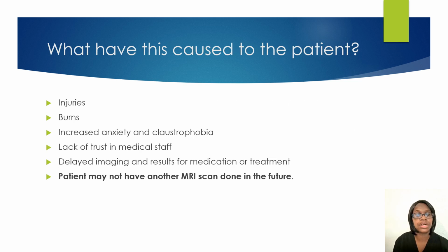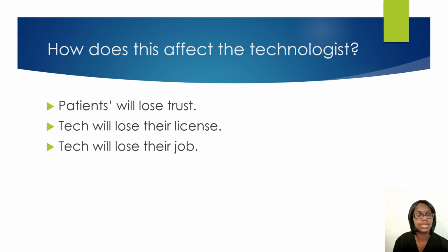Whenever things like this occur to the patient, it can cause injuries, it can cause burns, it will increase anxiety and claustrophobia fears, it will cause lack of trust in the medical staff, delay imaging and results for medication or treatment, and the patient may not ever come back for an MRI scan in the future. So when accidents like this occur, let's talk about how it affects the technologists. The patient will lose trust, the tech will lose their license, the tech will lose their job.